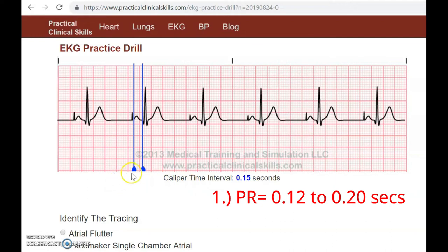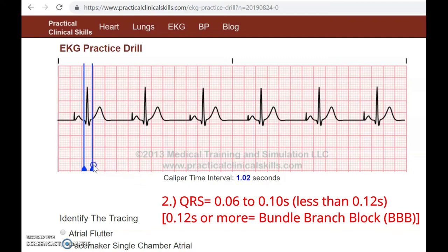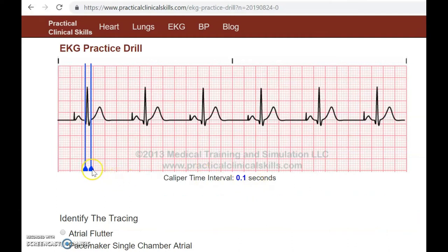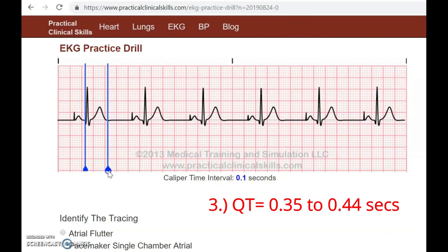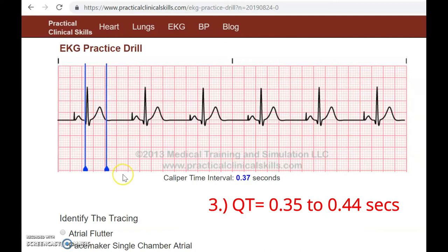Now we measure our QRS — it measures 0.10. Our QRS is normal because the normal measurement of the QRS should be about 0.06 to 0.10. If it's 0.12 or greater we call that a bundle branch block, but we don't have that because it's less than 0.12. Next we measure our QT, and this has to be less than 0.38 — ours is 0.37, so this is a normal QT.